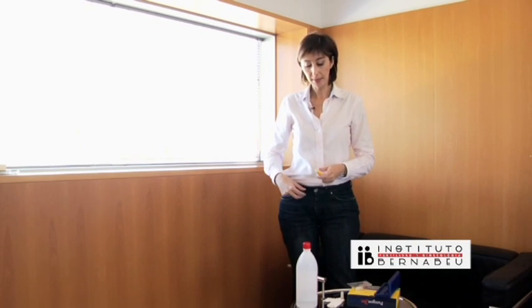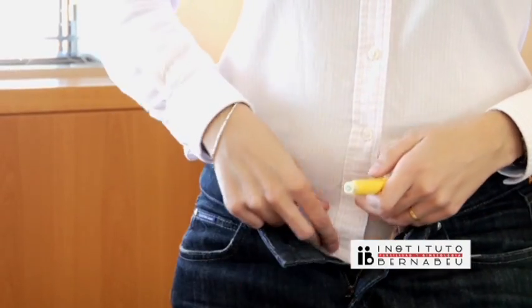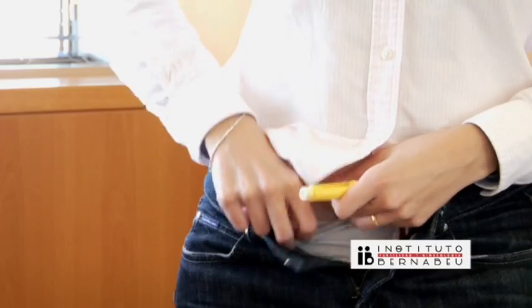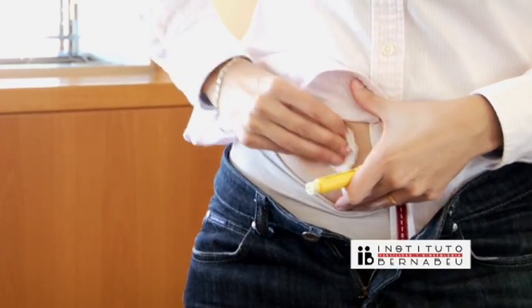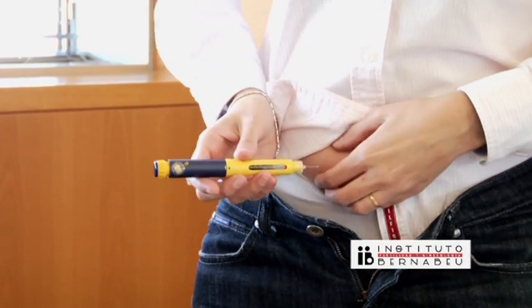First uncover your lower abdomen, which is where you will make your injection. Rub the area around your belly button with an alcohol-soaked swab. Pinch the clean skin and inject the medication.